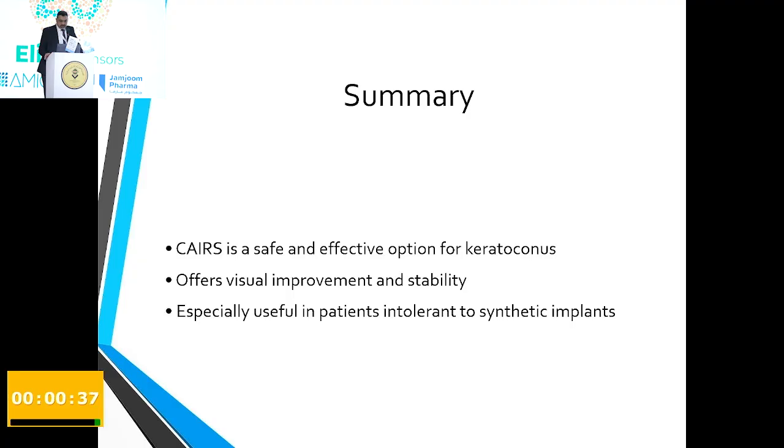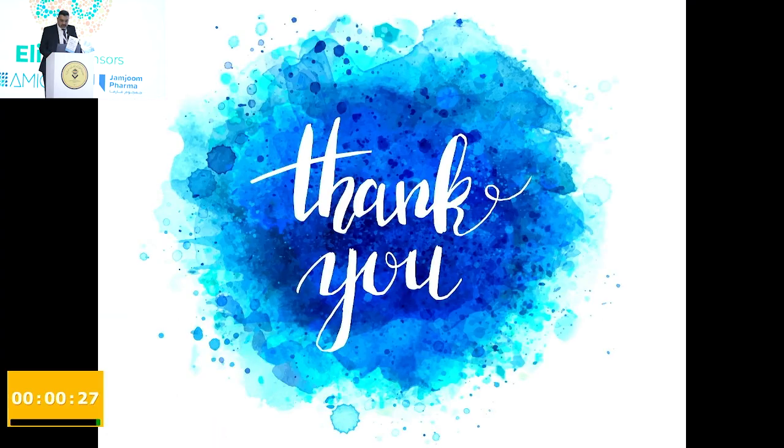And this is the summary. CAIRS is a safe and effective option for the treatment of keratoconus, and offers visual improvement and stability. We need further studies in the future to make the procedure more effective and more productive.